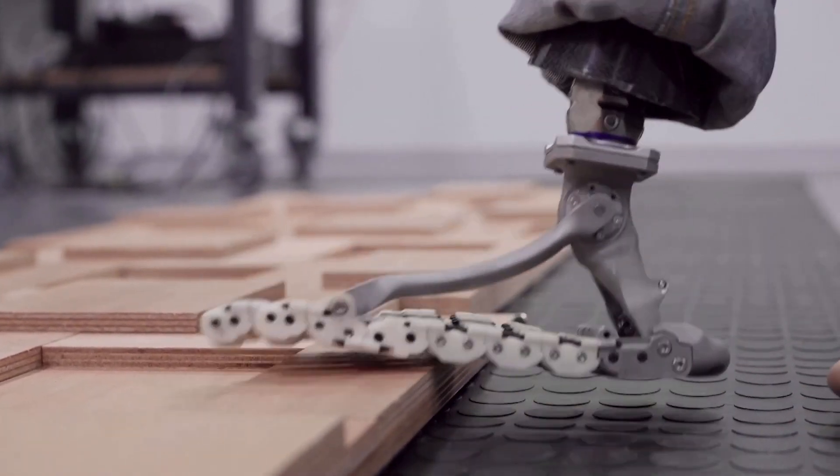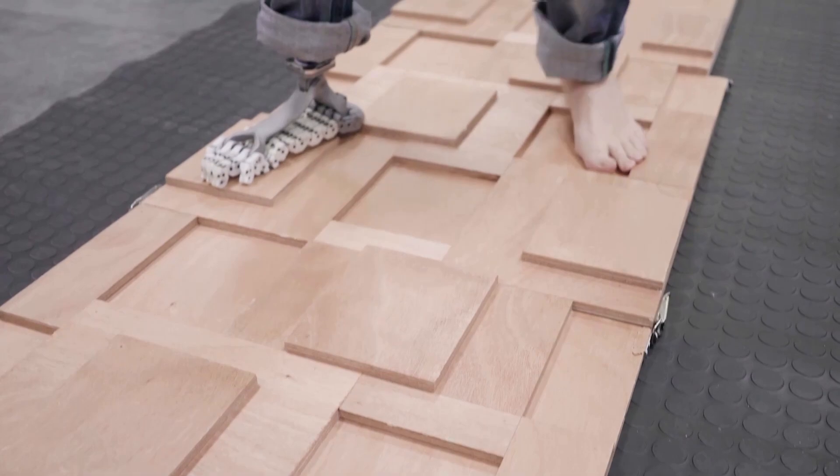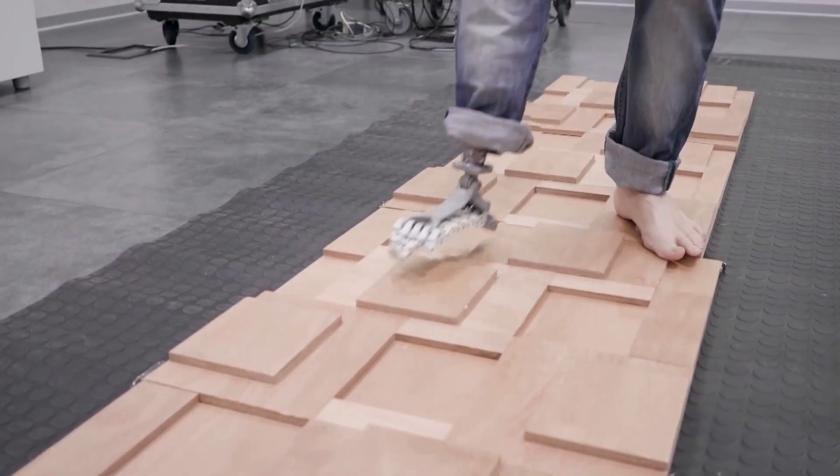The idea of the Softfoot Pro, born from the study of human feet, is to have a system that users can adopt every day in their life without changing the feet for specific tasks. This means that this prototype can be used in every condition of daily life.